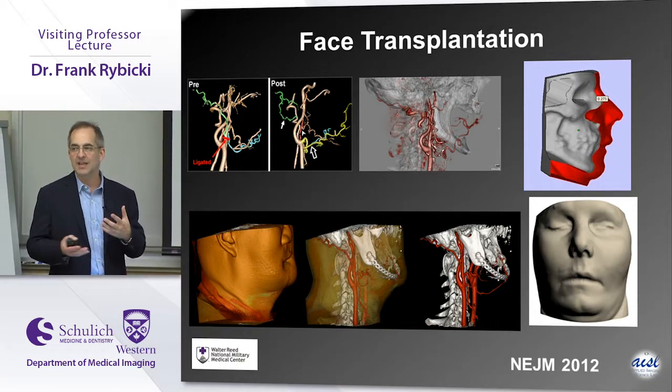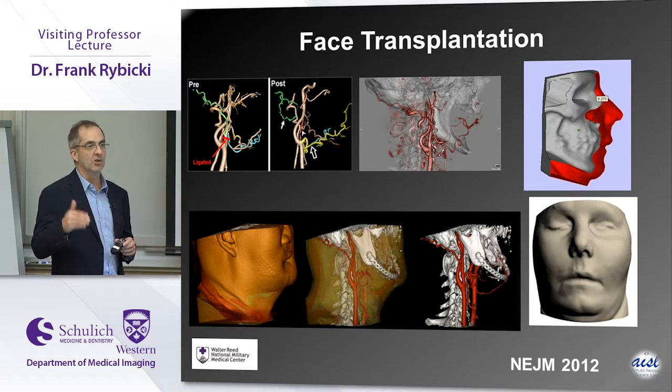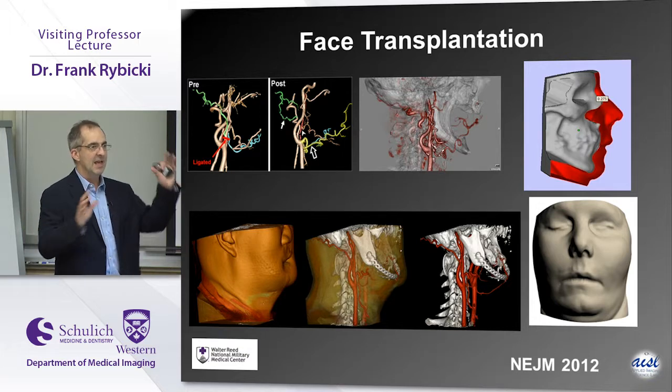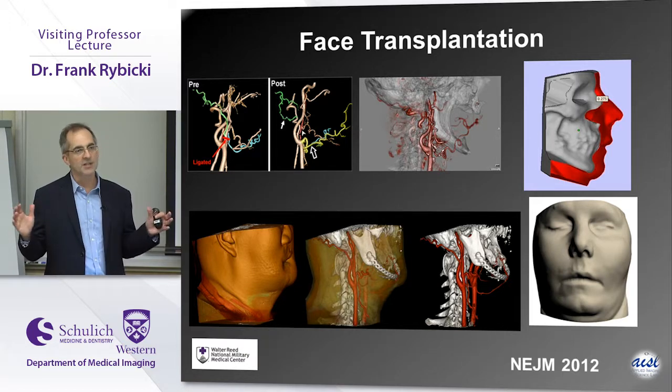It is very artistic. You can actually make a lot of metal parts. You can actually do a lot of surgical planning with plastics. And there's a large role for surgical planning and taking an operation that could be 20 hours and planning parts of it with 3D printing and medical modeling and shrinking it down to a procedure that's 10 hours. And so there's a huge cost savings.